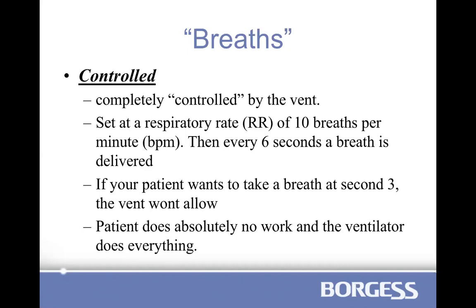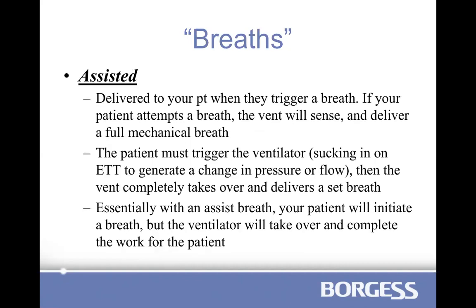Now imagine you have a straw in your throat and somebody forces air into that at a set pace and a set cadence. In natural life, we all breathe a little differently. Each breath is a little different. So on the ventilator, each breath is exactly the same, especially in this type of controlled breath mode. In an assisted mode, this is when the patient actually triggers the vent and gets that full breath, okay? So on that first picture where it had the C in the corner, that means the patient did not initiate the breath, the machine did the whole breath.